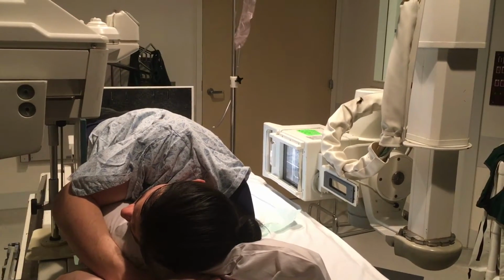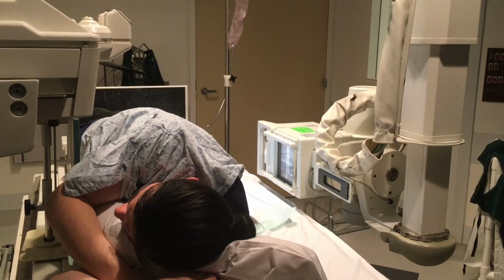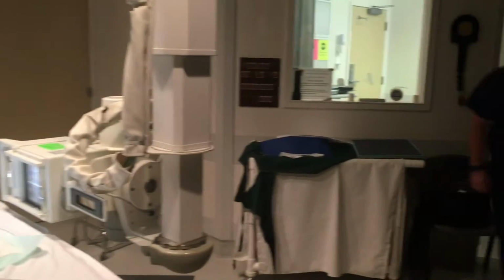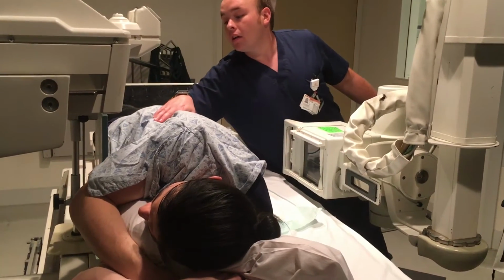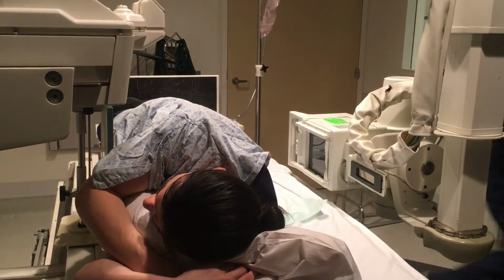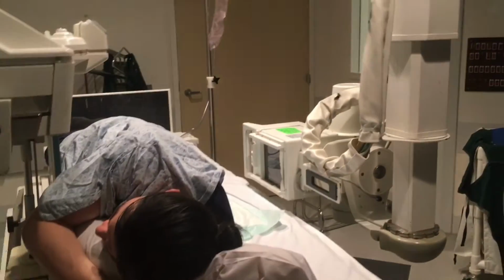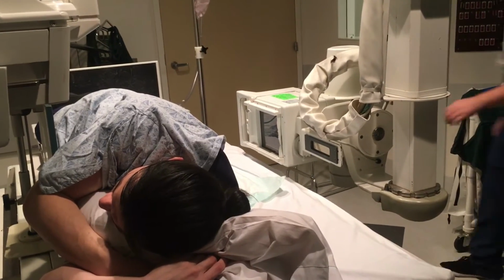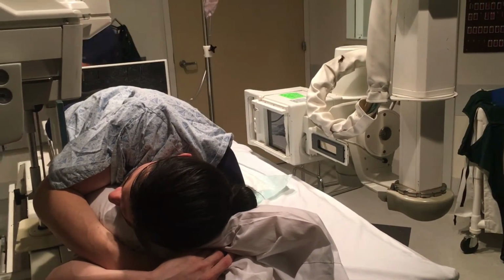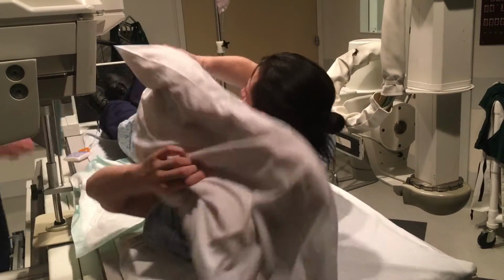Alright. Technique's going to be 85 at 70. I upped the mAs a little bit because of this air gap. Sometimes the patient can't really touch the board. Taking a deep breath. Blow out. Hold. X-ray. Alright, breathe. We're going to do the same thing, but this time I want your back against here. So if you could do that for me.